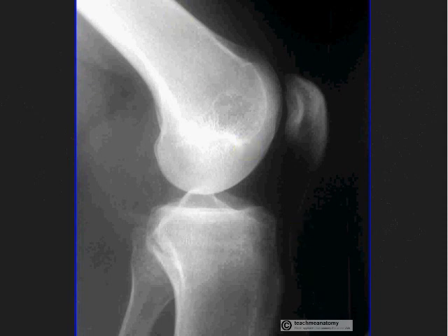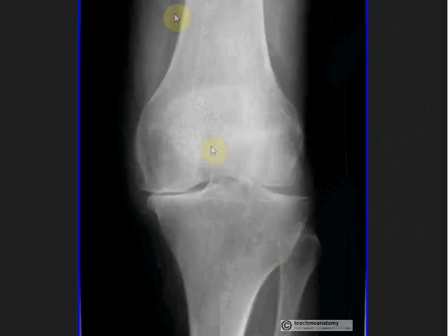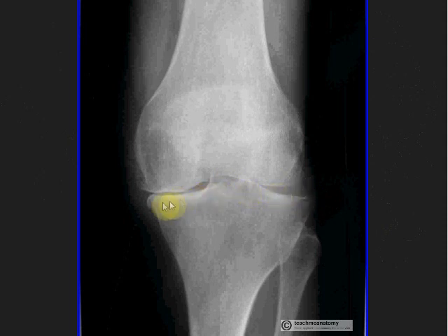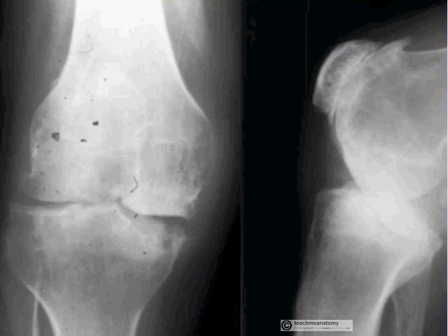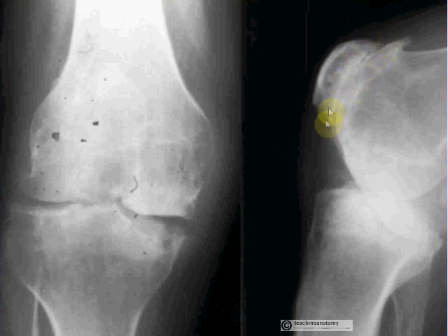Just for this video I thought I'd quickly show you what a bad knee looks like. We saw this knee here, which looks nice with a clean joint space. This one has a much reduced joint space. You've got little bony spurs we call osteophytes — you can call it osteophytic change. So this would be the appearance in osteoarthritis. You've also got something called subchondral sclerosis here, which is an increased whiteness underneath the joint. And here's a really nasty knee of advanced osteoarthritis — you can see the joint space is very poor, you've got subchondral sclerosis, subchondral cysts, and osteophytes. And you can see the patellofemoral articulation here is just completely gone — the patella is just rubbing against the femur.